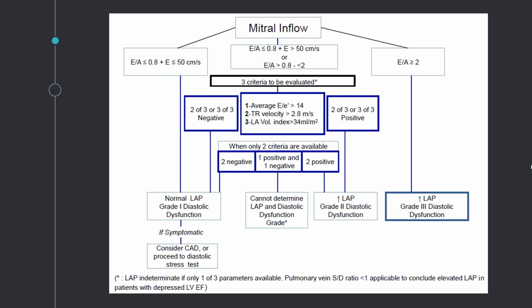I guess the reason for that is that, looking at all the diastolic parameters, E over E prime over 14 was the only one that was systematically associated with outcomes in different populations, like cardiomyopathy, different diseases. So I guess that's why this one stuck more, and it was easier to study as a number. And that's why, with the SAPIEN registry, when we studied the diastology using this, having the combination as they suggested in this guideline was also associated with prognostic implications.